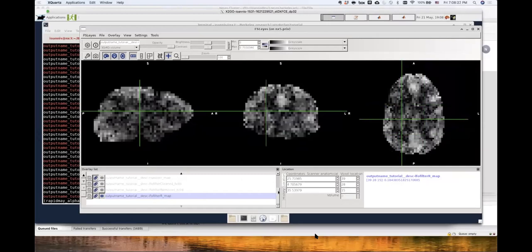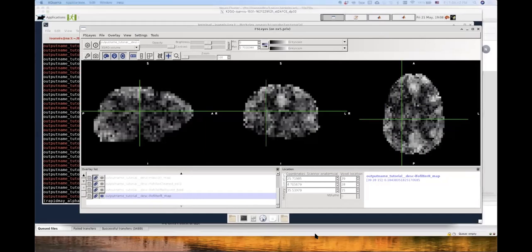So I've shown you a bunch of files, starting from the lag map, the correlation map, the actual clean data, what was removed from the data, and how the GLM performed in each voxel. All of these overall will give you an idea as to where the LFO signal lives in your brain, and eventually how to remove it from your data.